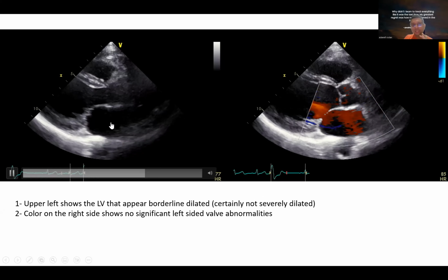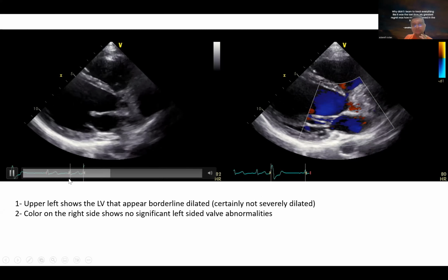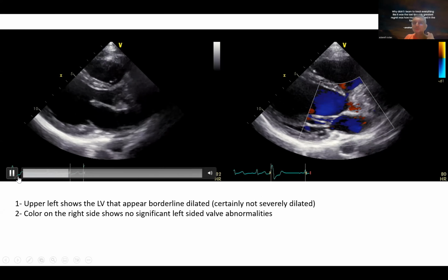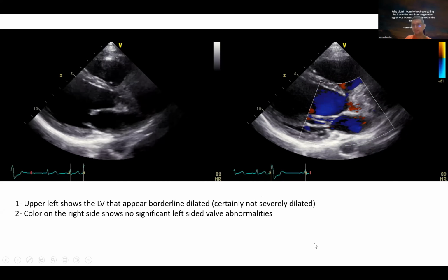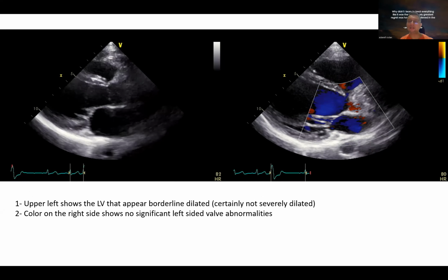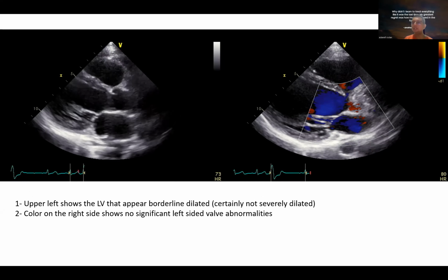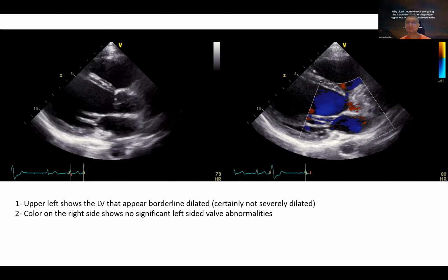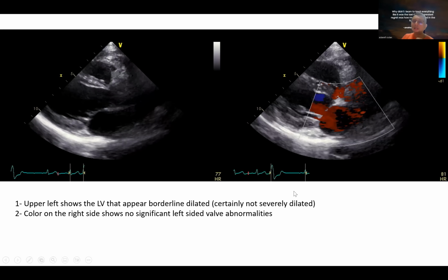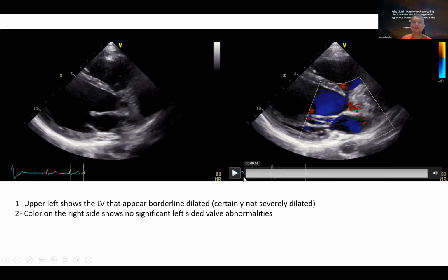In fact, if you look carefully as the beat goes, when it goes into a normal beat, the contractility is acceptable. Only when it goes into PVC is the contractility not good, right? So the actual ejection fraction is not 35%. Maybe it was between 45 to 50%, but not 35%. Okay, so beware of assessing ejection fraction in someone with arrhythmia and frequent PVC.